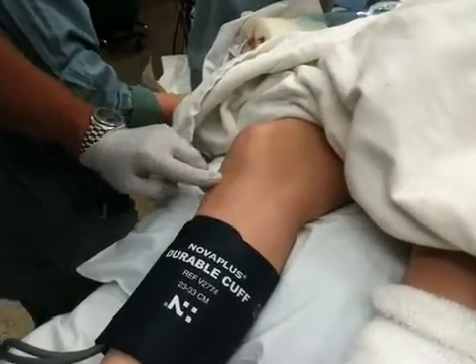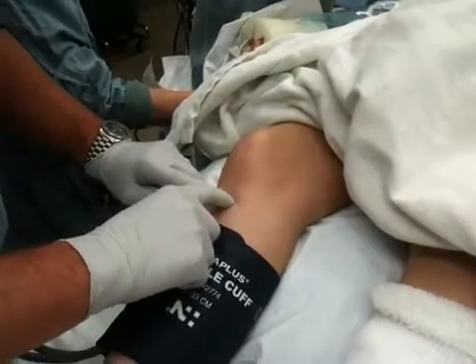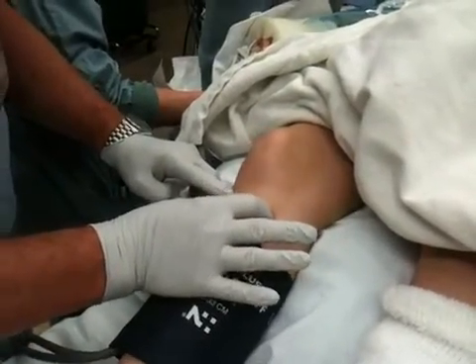This is the lower border of the patella, two centimeters below the tibial tubercle, two centimeters medial to that. We're in the middle of a big, flat, expansive bone.